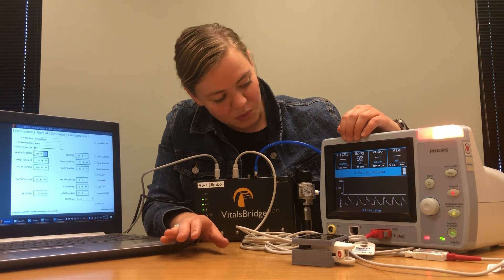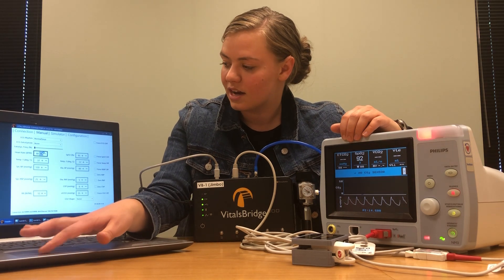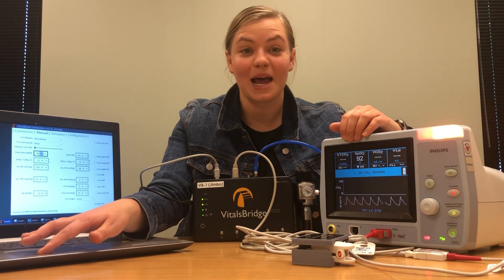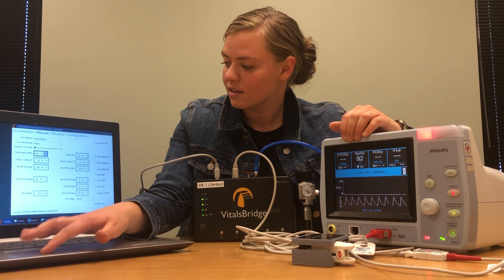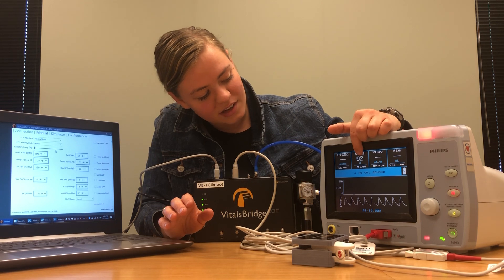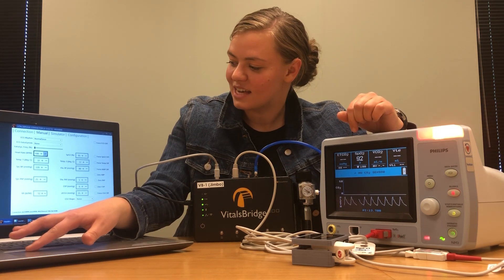Just to make sure that everything is working the way that I want it to be working, I'm going to adjust my heart rate down to 60 — or I guess I'm adjusting it up to 100. Once it's been adjusted, we'll wait for it to update, and it looks like everything is working as it should be. So I'll bring that back down to 80.